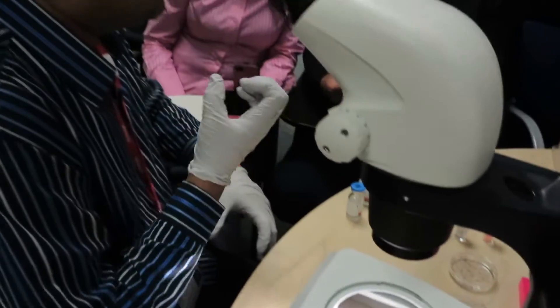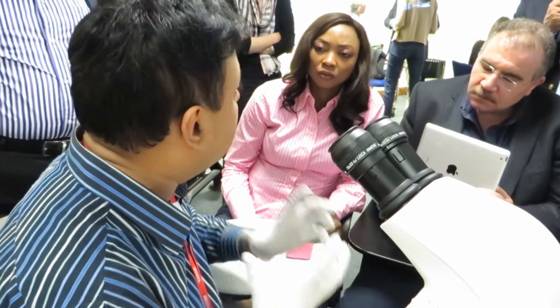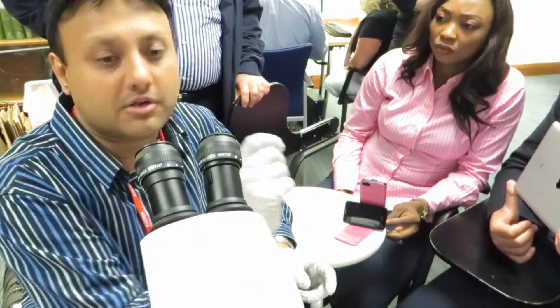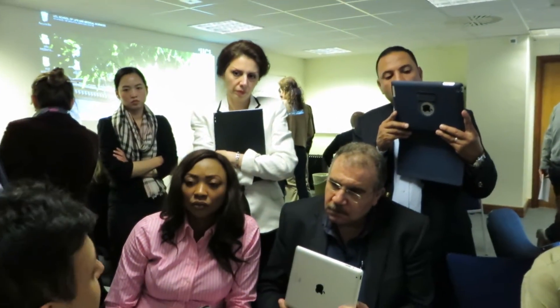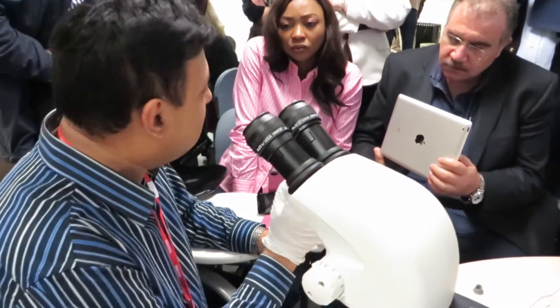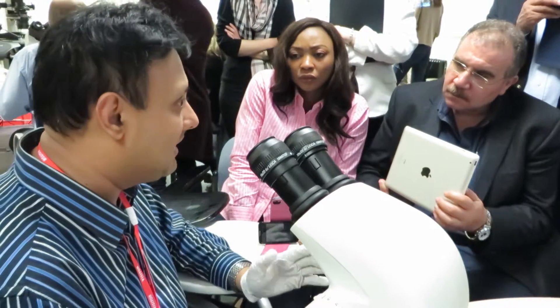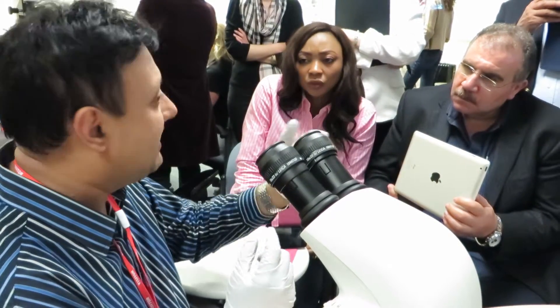When we do blastocyst vitrification, especially after a biopsy, the cavity is already collapsed. If the cavity is not collapsed and is fully intact — such as in routine vitrification — we puncture the cavity by applying a laser shot at the junction of two trophectoderm cells, at the opposite end from the inner cell mass. We believe the success we get is because of the reduced intracellular volume of water, since the key to cryoprotectant success is draining the water. You'll immediately see the embryo collapse.